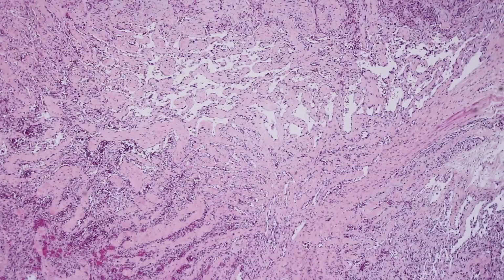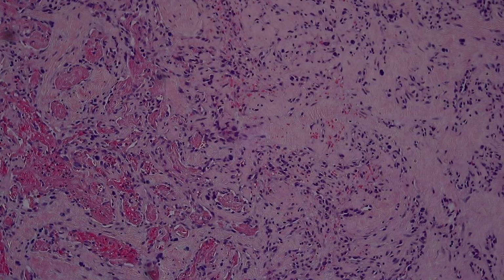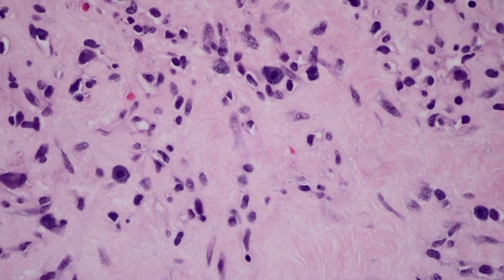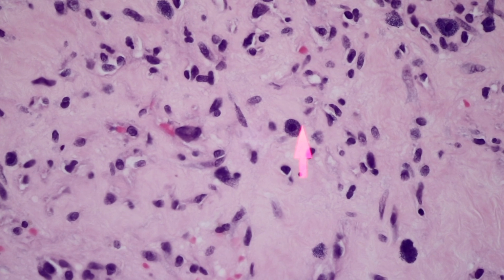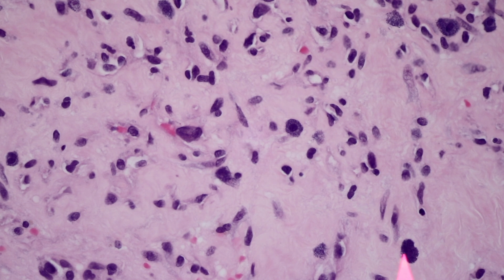Usually the staining is a lot weaker than what I just showed you, but here's the H&E of that same anastomosing hemangioma I just showed you, and just to give you proof that these are really mast cells. See? That little guy in the middle, a little fried egg with blue granules. And there's another one up here, and there's another one down here. So it's really interesting to me that this happens.